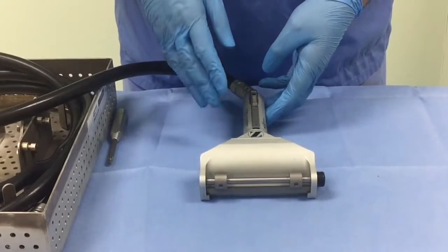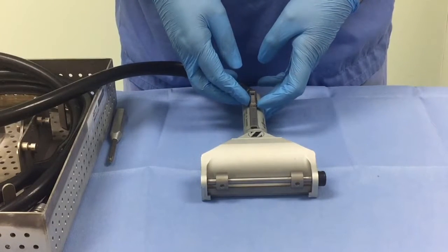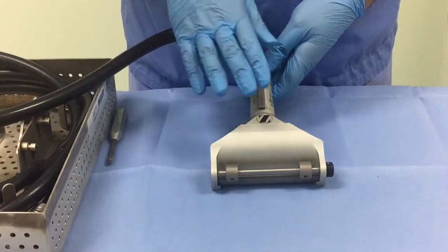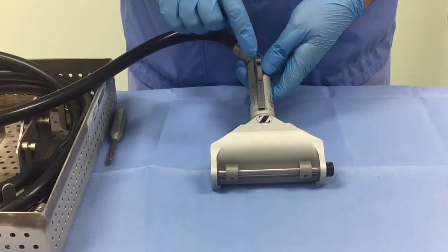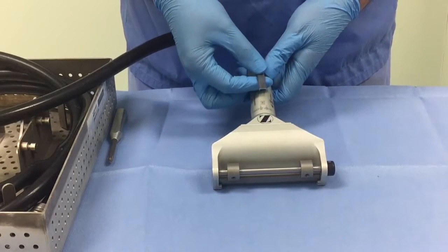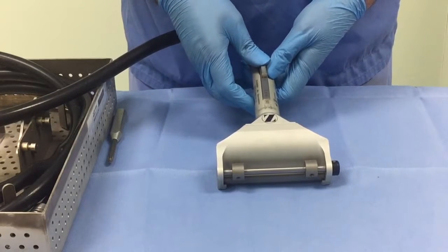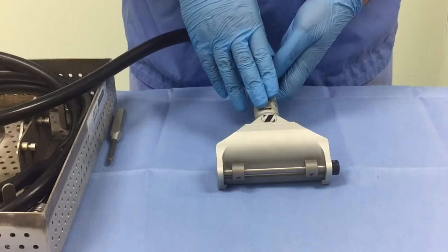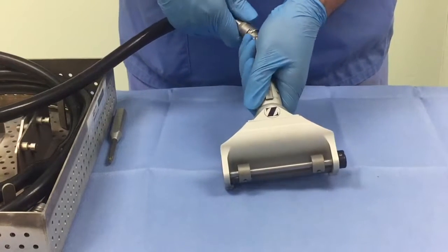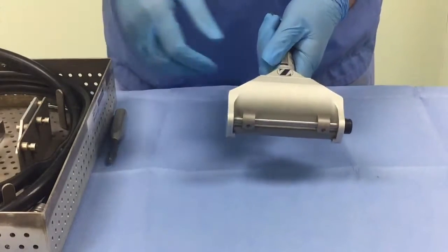I am going to tell you now how to take off the skin graft blade once you have taken your skin graft. Just make sure that before you start dismantling the pneumatic dermatome, the lever is on safe. Once you have taken the skin graft, slide it onto safe and make sure it is flush with the handle. Then disconnect the pneumatic hose from the base so that it is easier to handle.